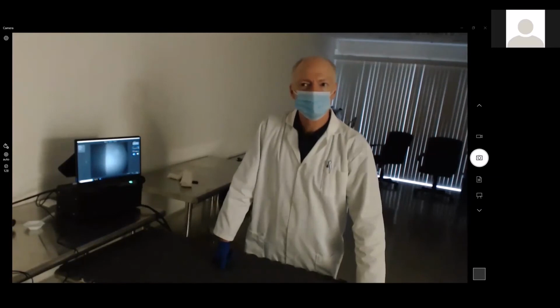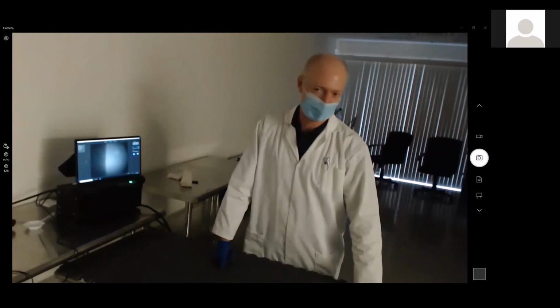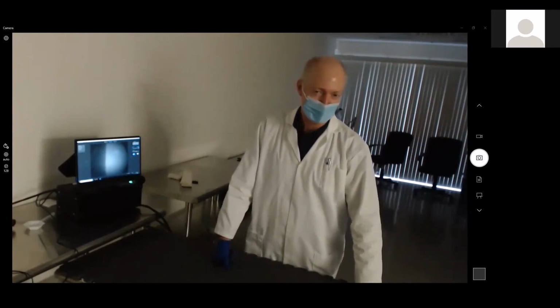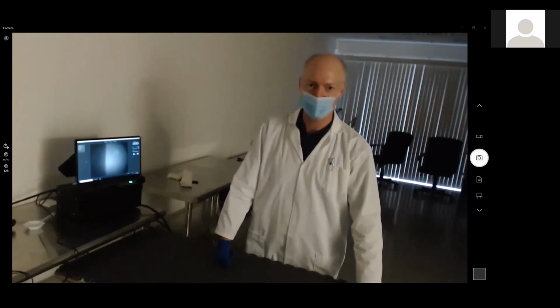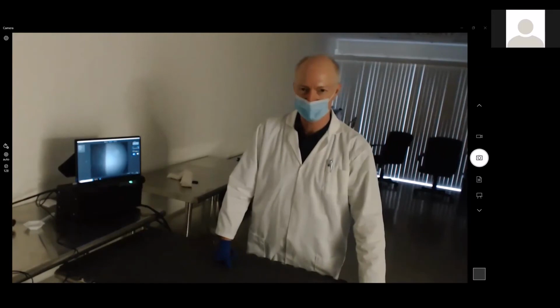I think it's just by pixels. I think you're right. I'm not sure exactly what feature in the software you're looking at, but I think measurement is going to be pixel values. And then, of course, based upon the number of pixels on screen, you can calculate out how that translates into some conversion of microns or metric.